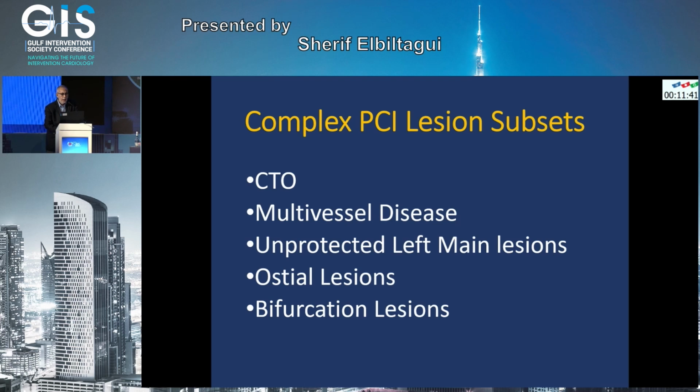The CTO is on the top of the list of complex PCI lesion subsets, which also includes multi-vessel disease, unprotected left main, ostial lesions, and bifurcation lesions. But when you have all these subsets in one single case, you expect that it is really complex and lengthy.